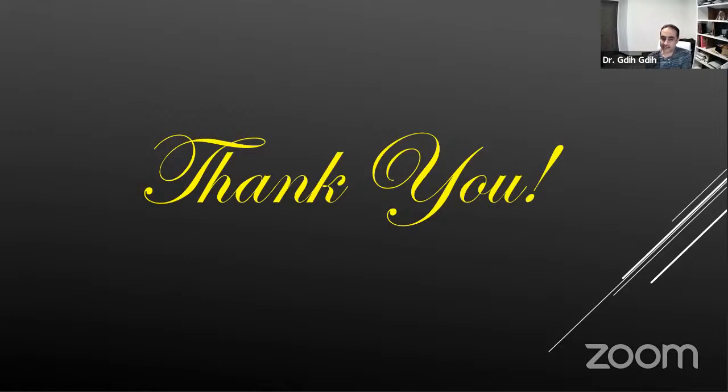And I would say yes, the least that you can do if you have only Octopus is to apply these points to the Octopus machine as much as you can. I have no experience with the Octopus, and I don't use it, to be honest. But I sometimes face a patient who comes to me with a field that was done elsewhere, and they ask me to look at it, and I find very similar points. So yes, you can apply those points to that.